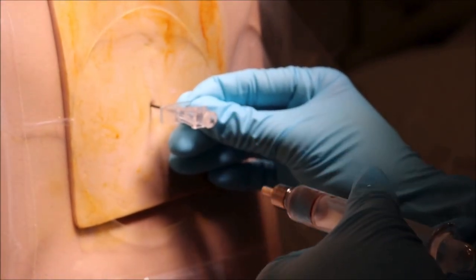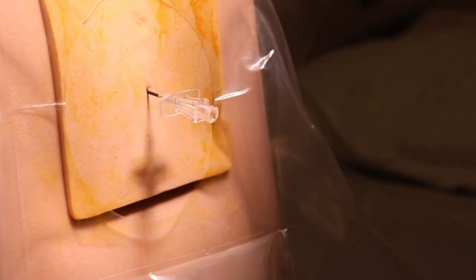As you can see, there are 2 striated markings left on the TUI needle, so we know that we are 7 centimeters in. You should leave about 4 to 6 cm of the epidural catheter beyond the point of loss of resistance. Leaving less than 4 cm increases the risk of dislodgement, while more than 6 cm can lead to unilateral block or hot spots. You can pause and look at the marking at the skin here.